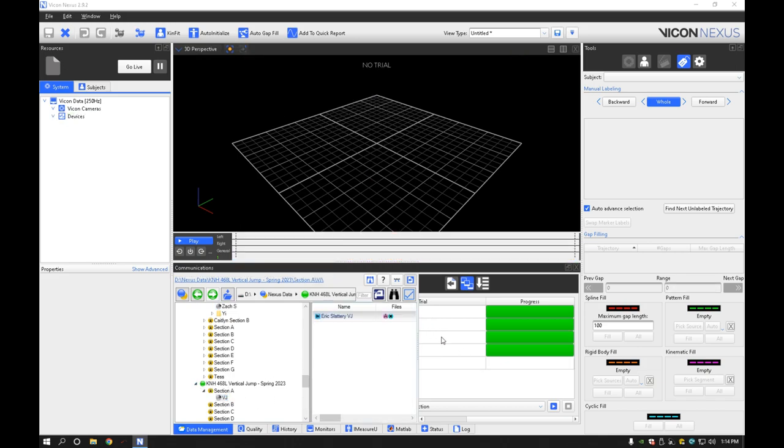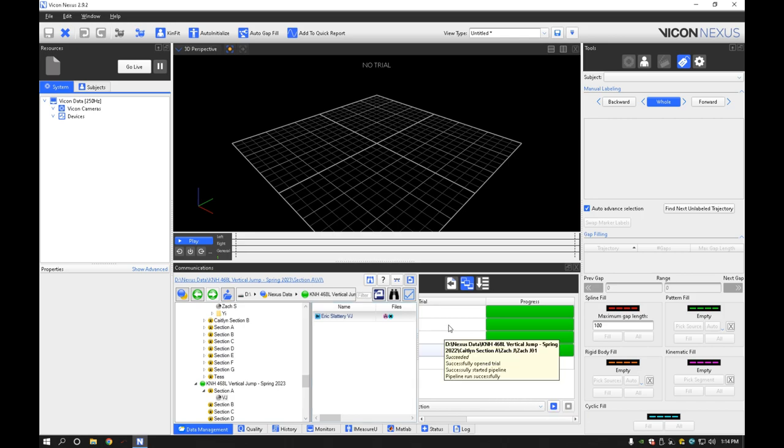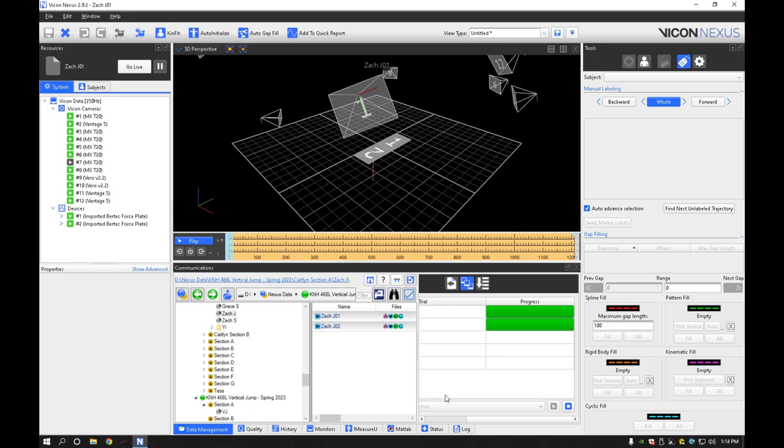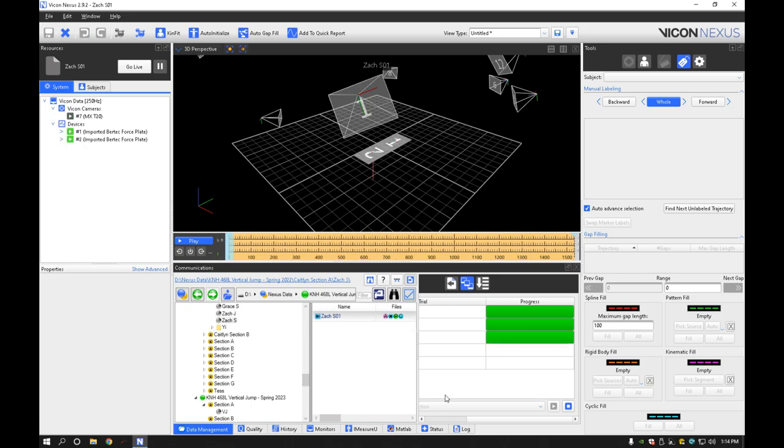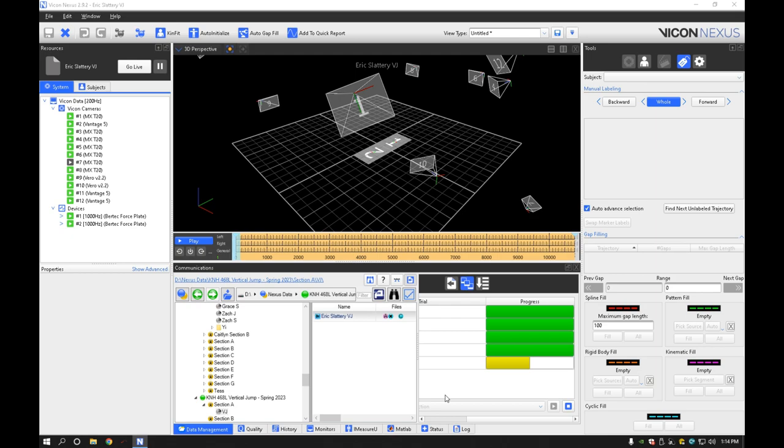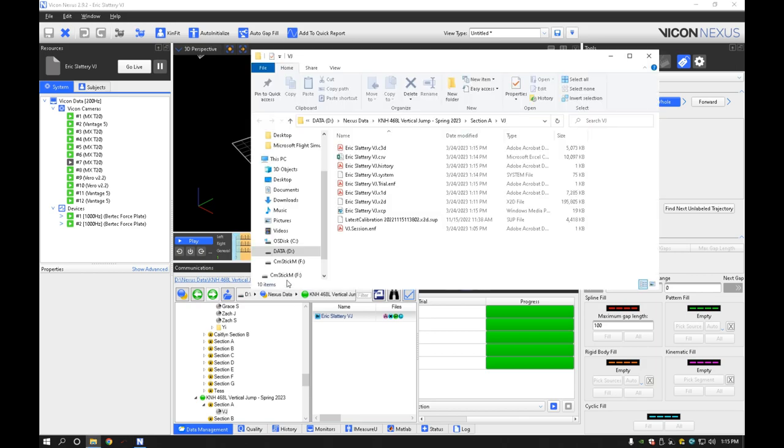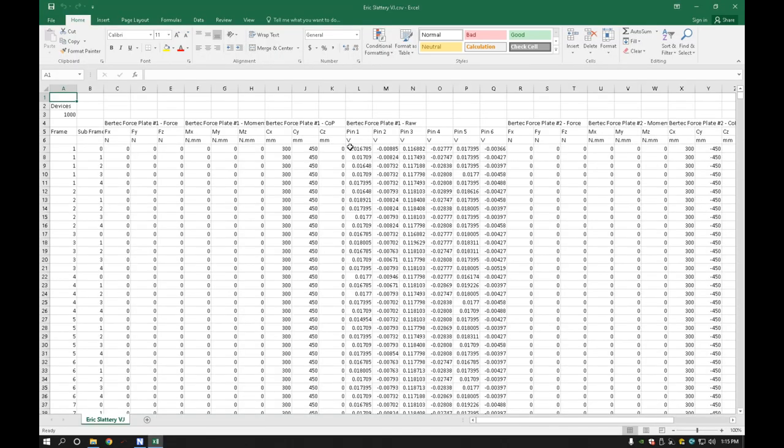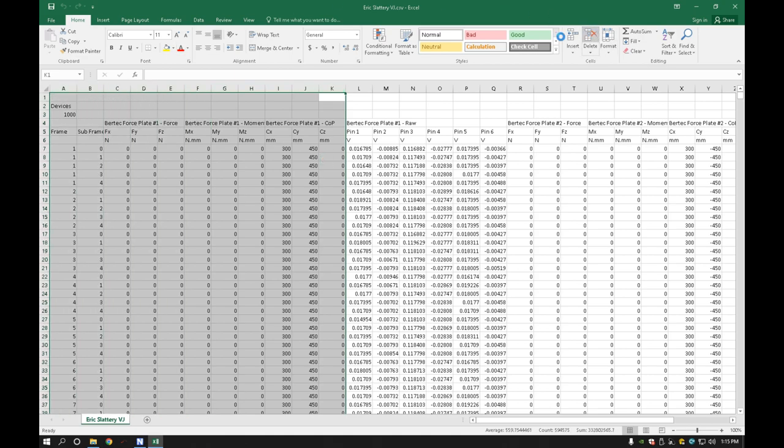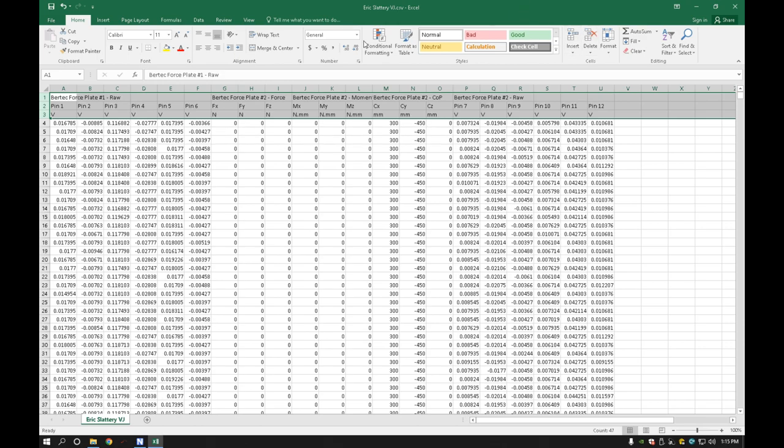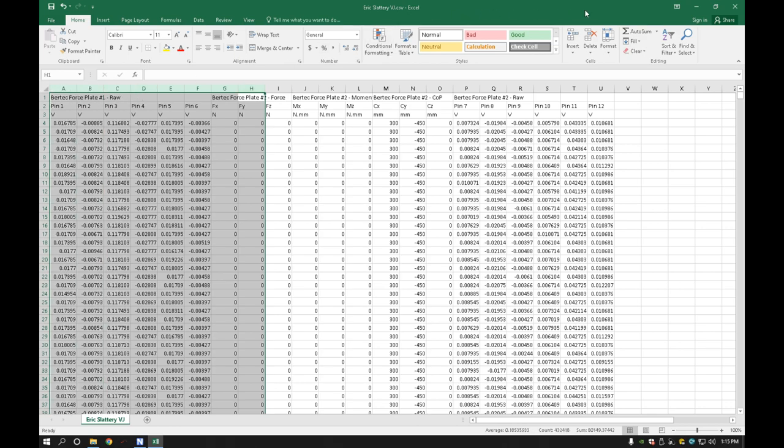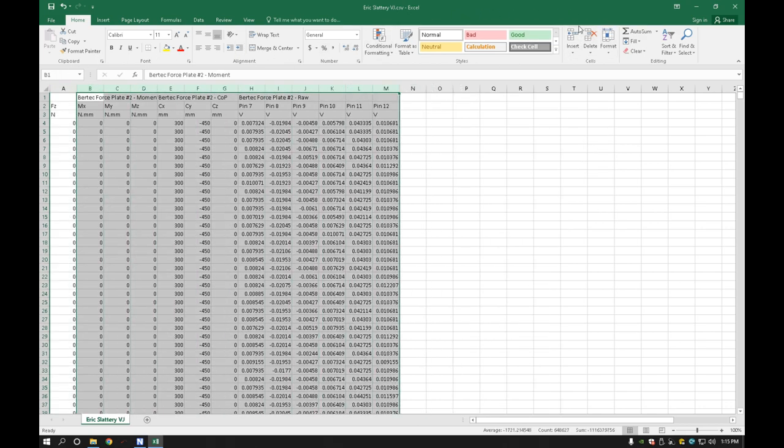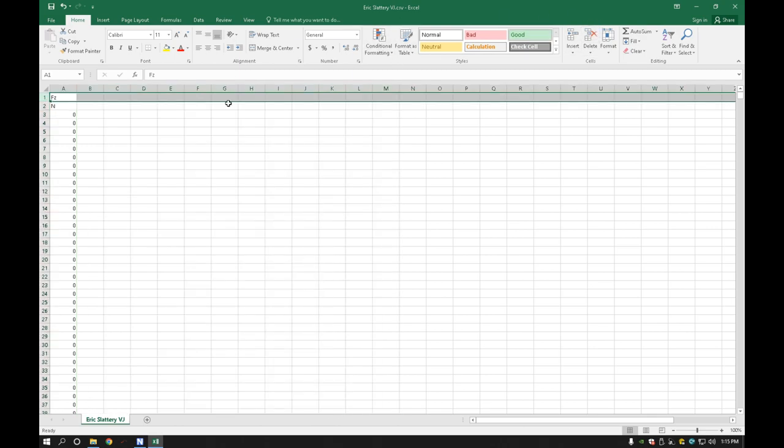Let's go ahead and mark that. And we will process. Oh, that's okay, I processed them all again, that's alright. I try to only have like six to eight seconds of recording because we don't need any more. Alright, cool. So we got that. Open it on up. So the one force plate's all zeros, except for the center of the plate. Don't need all this. So let's go ahead and just delete that. And actually the only one we're interested in is FZ on this force plate. So this is literally all that's needed.